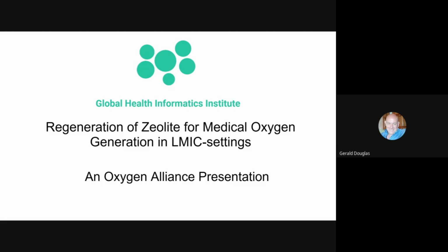If you're trying to repair an oxygen concentrator, and the device that you're using for regeneration is actually based on oxygen concentrator technologies, then already you understand it. If you have a problem with the regeneration device, it's basically just like working on another concentrator. We use a concentrator for the dry air source. We use compressors from concentrators for the vacuum source, and the rest is essentially just the heating element and the crucible.